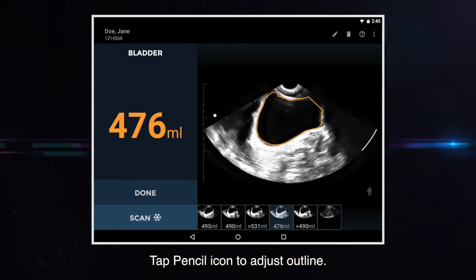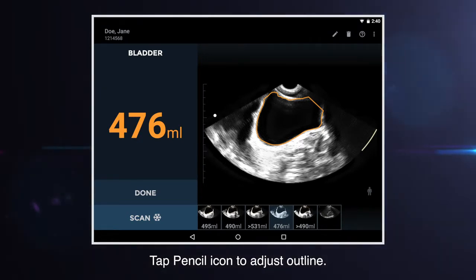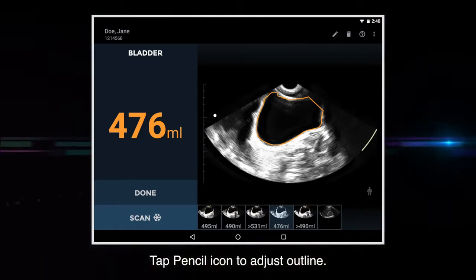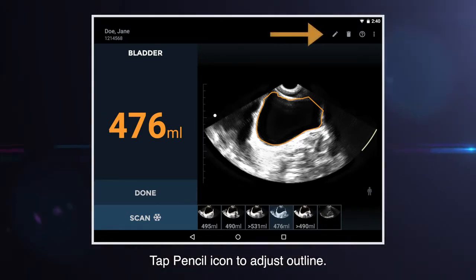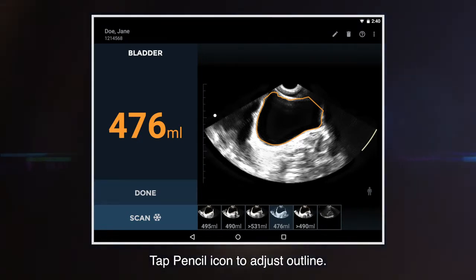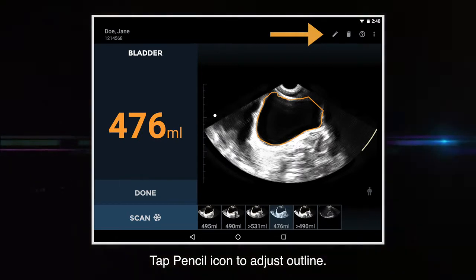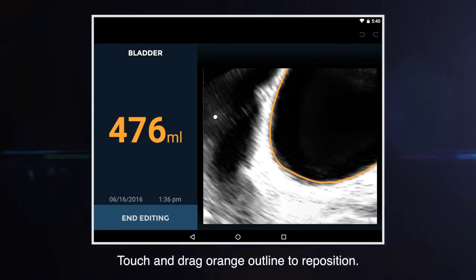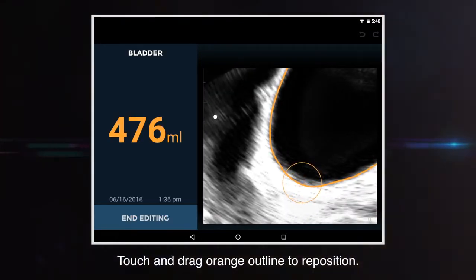If the orange outline does not follow the bladder wall, it can be adjusted. Tap the pencil icon, then touch and drag the outline to reposition.